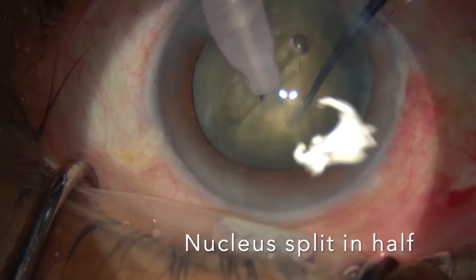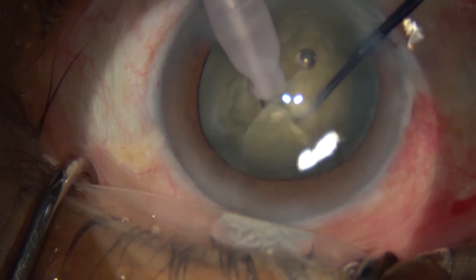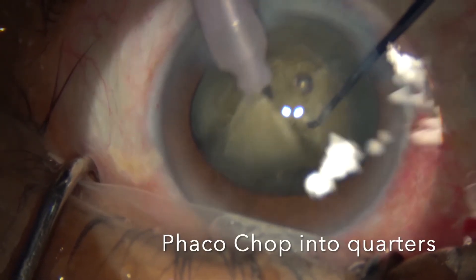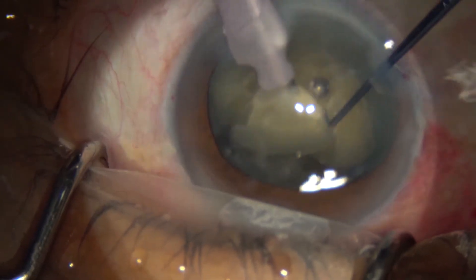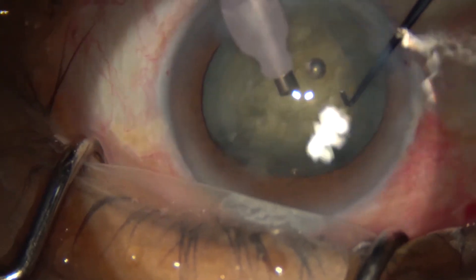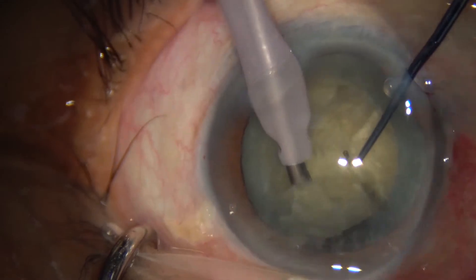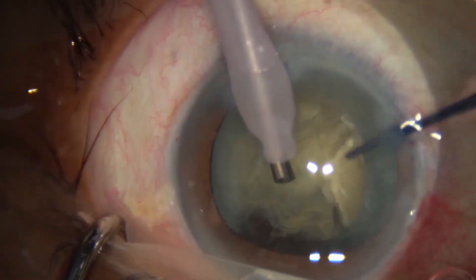After deepening the groove, we then have the ability to split the nucleus in half. Then we do the chopping technique — using a second instrument, the chopper, we split the halves into quarters, and then we phaco-emulsify the cataract, using ultrasound to break up the cataract before it is suctioned away.